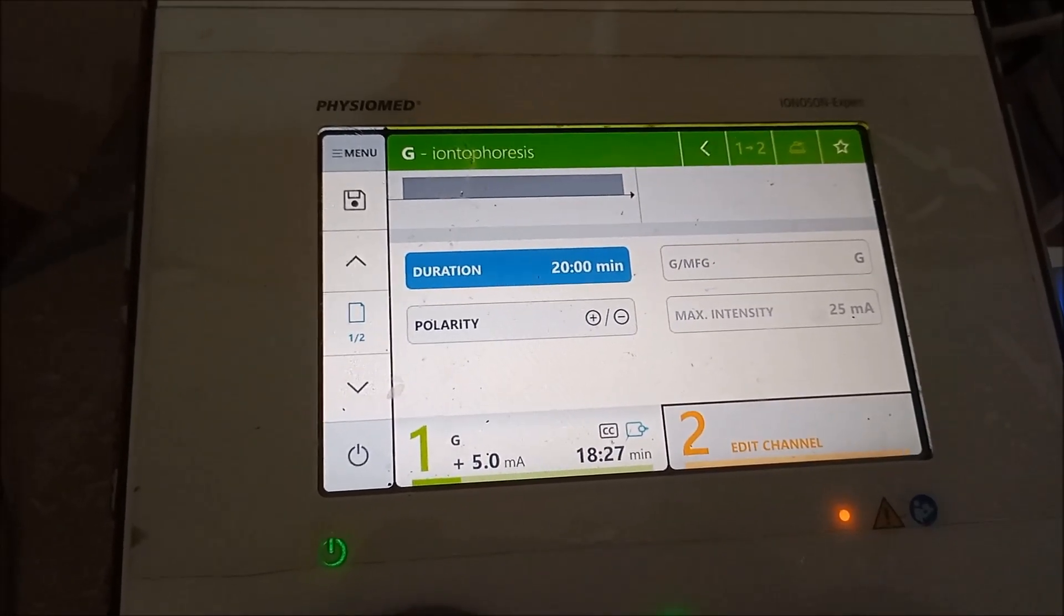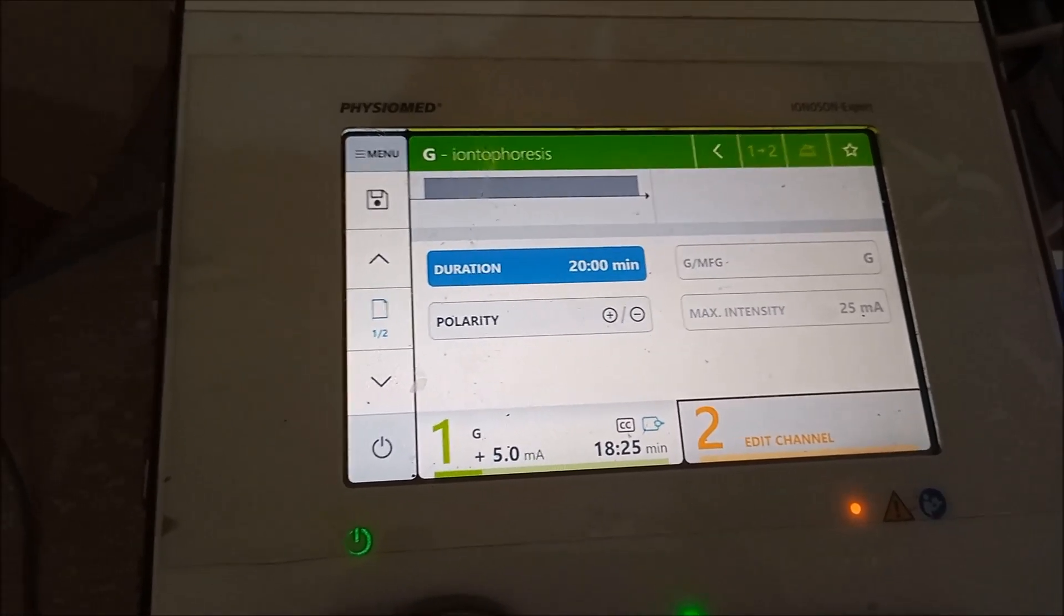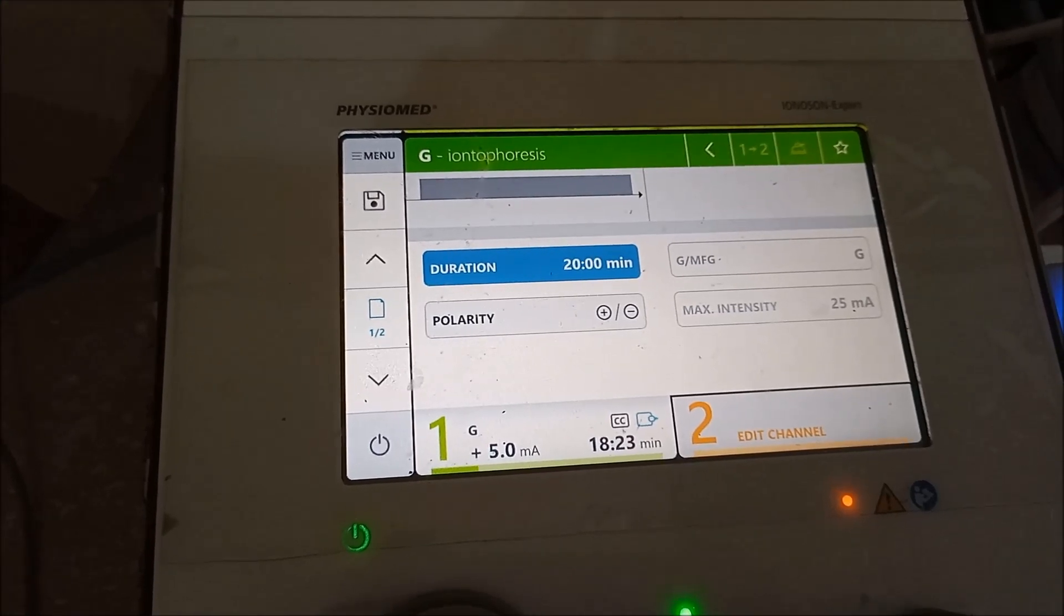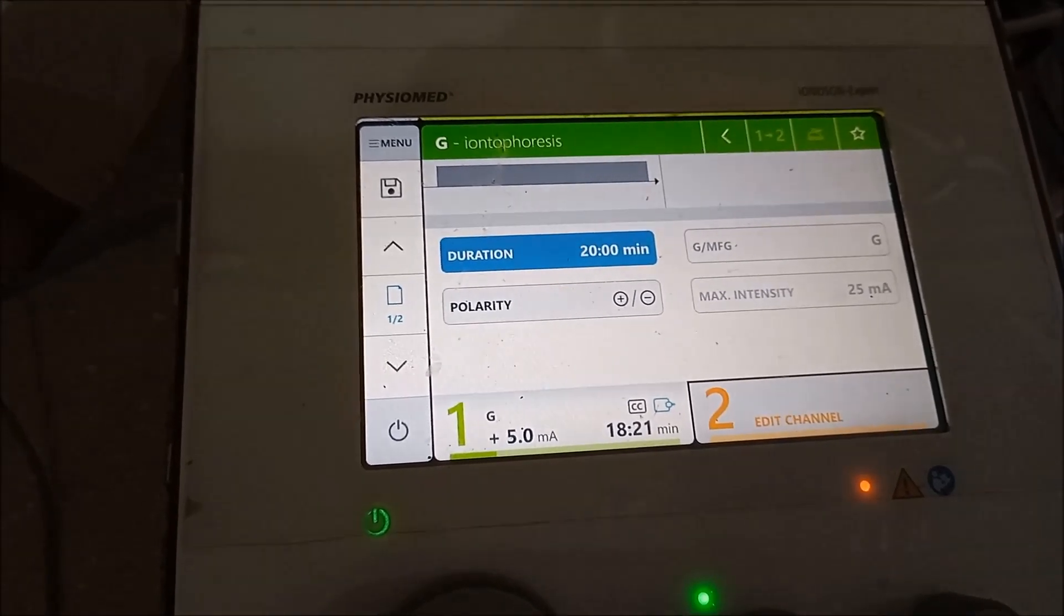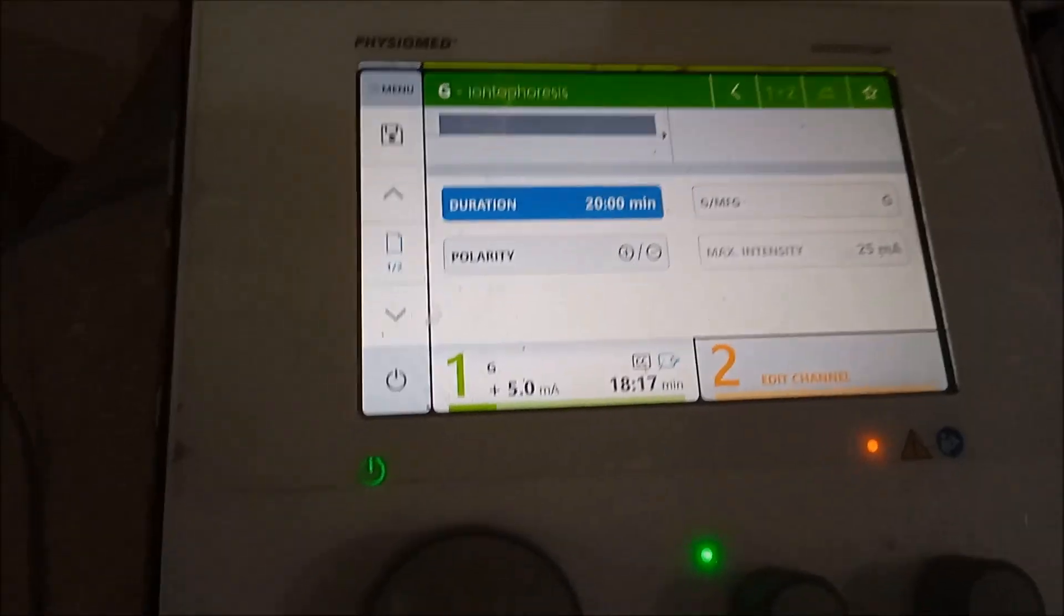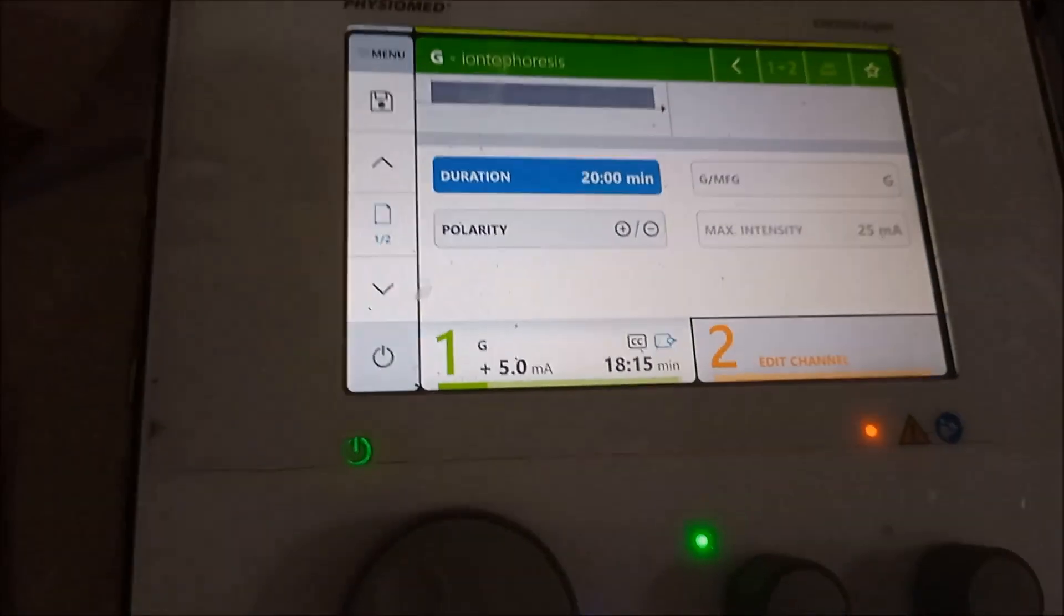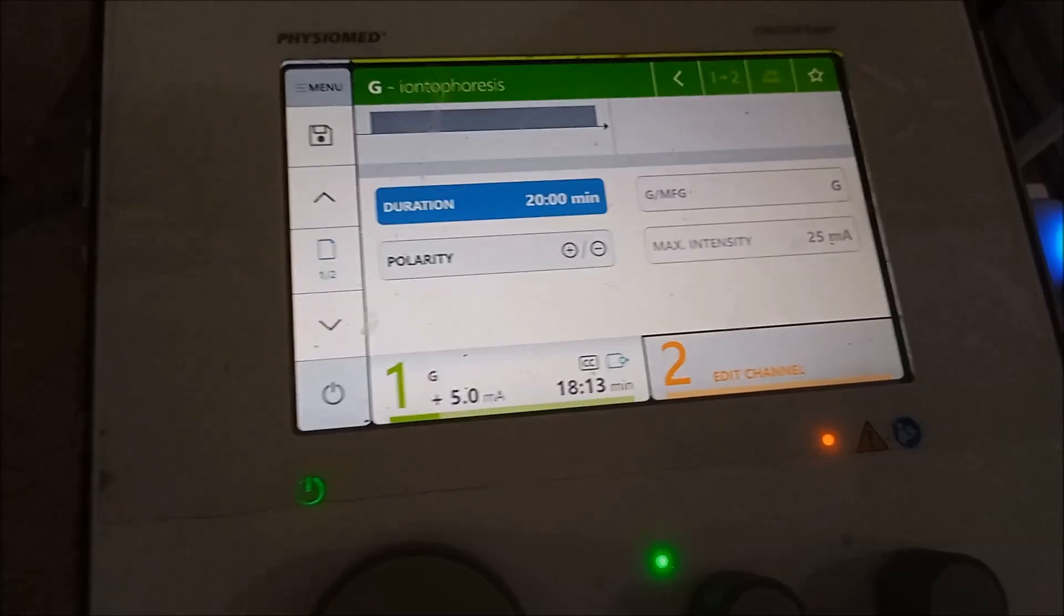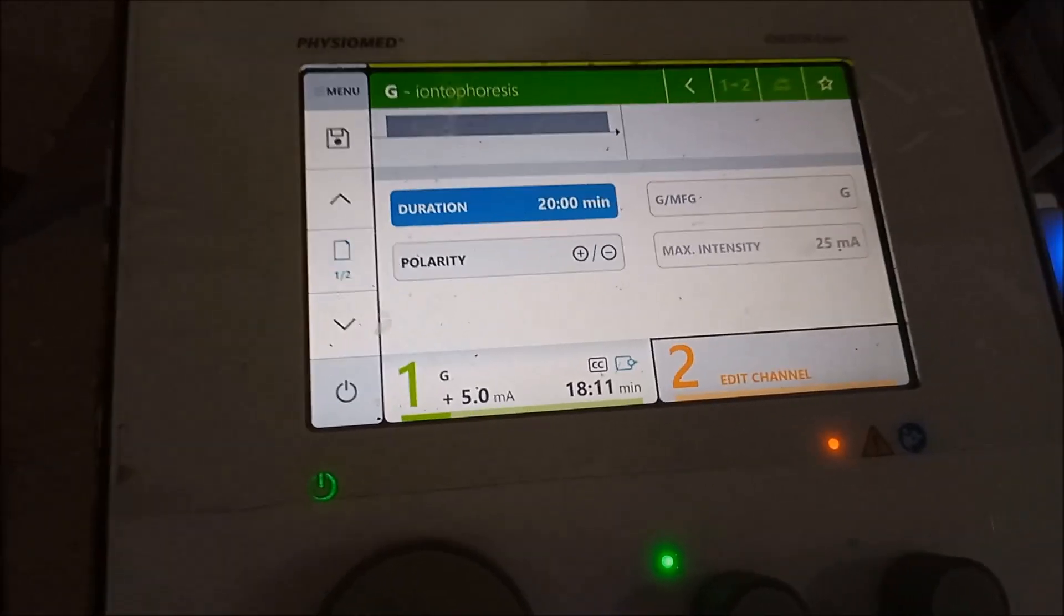We are using the galvanic current or direct current. This is plain galvanic current with no interruption involved. We are currently treating the patient for 20 minutes and the polarity is set to change - positive and negative is going to change depending on the time.